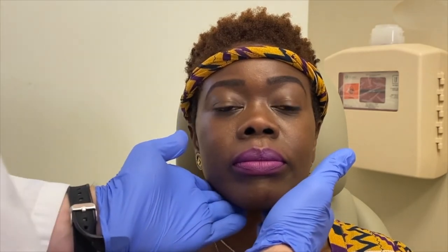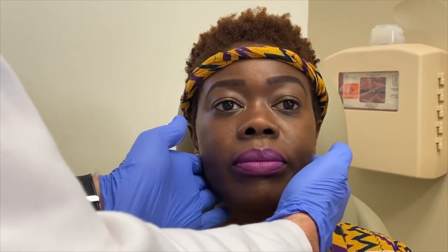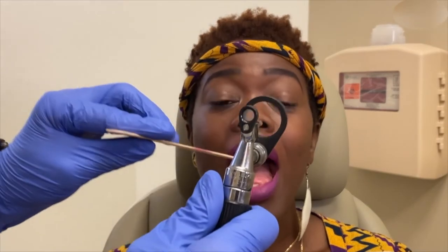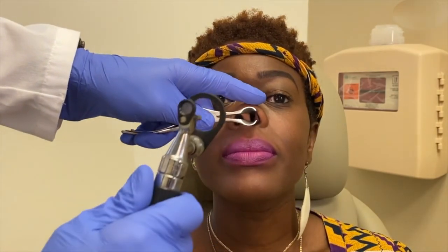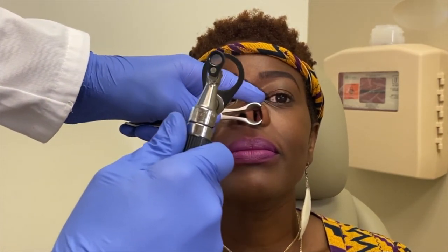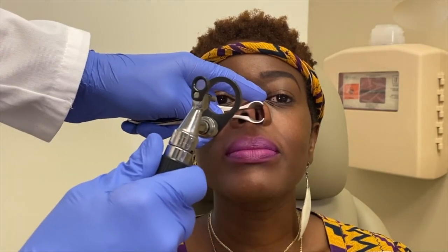Ask the patient to find a comfortable position in the examination chair, then perform a complete examination of the head and neck. Facial asymmetry or cervical lymphadenopathy may be suggestive of a neoplasm. Hemotympanum may indicate that blood has refluxed through the eustachian tubes to the middle ear. Blood or a clot in the oropharynx may indicate active or recent bleeding. To evaluate the anterior nasal cavity, perform anterior rhinoscopy using a nasal speculum, making sure that the lighting is adequate for visualization.